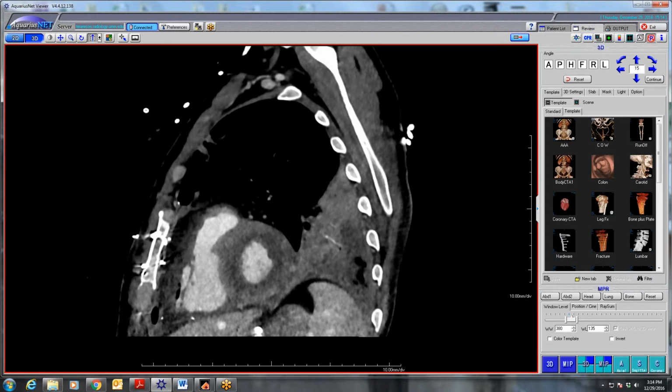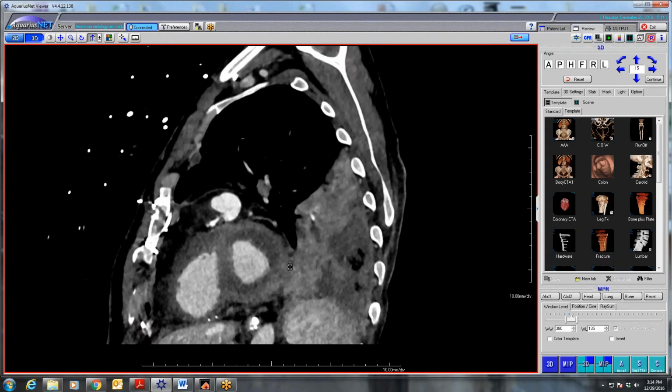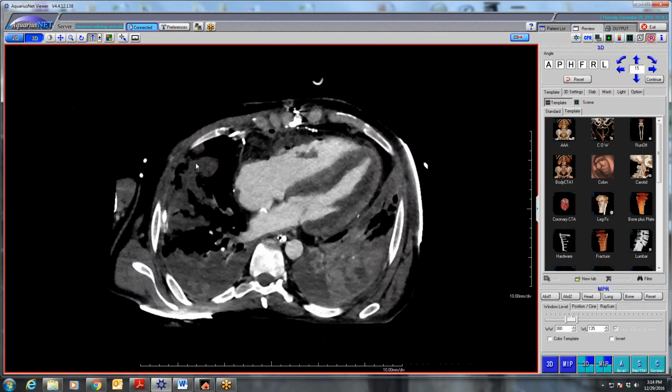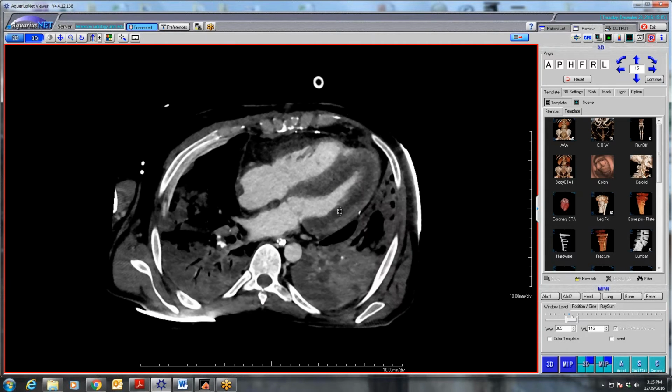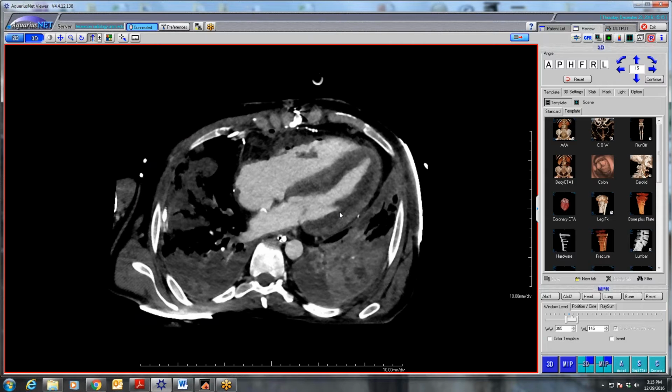So, you know, I've just never seen such an extreme myocardial injury. And this guy was alive for a while. They kept him alive on ECMO and other methods, but basically acute infarction of the entire coronary artery tree. So, bad news. But all right, those are my cases.